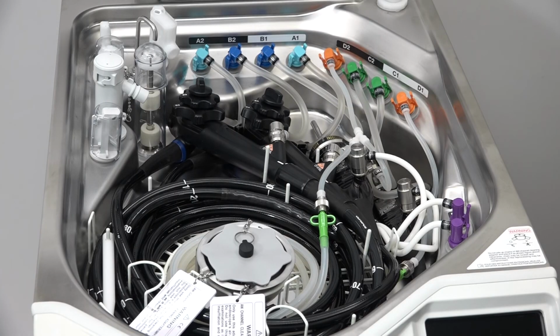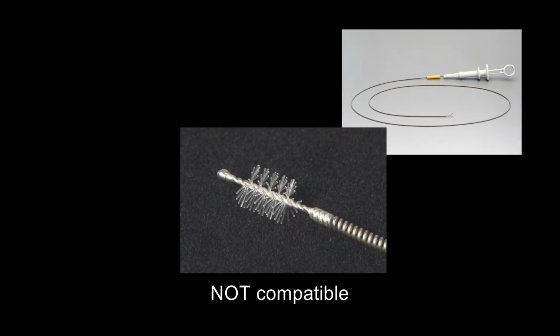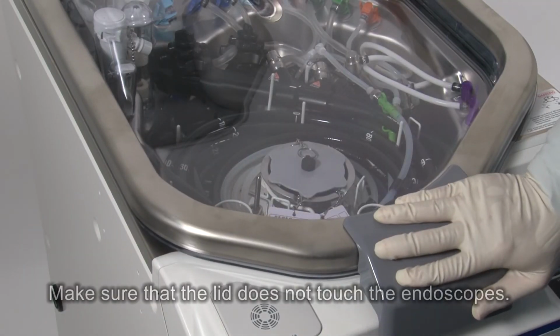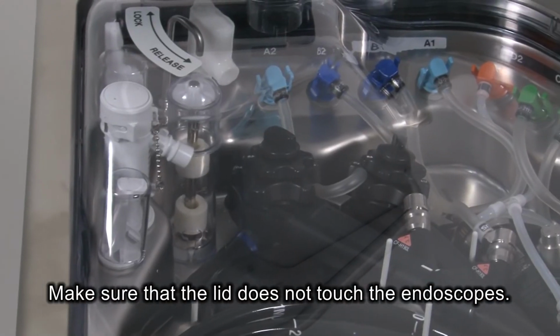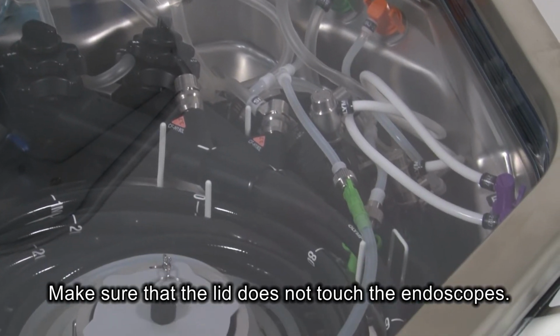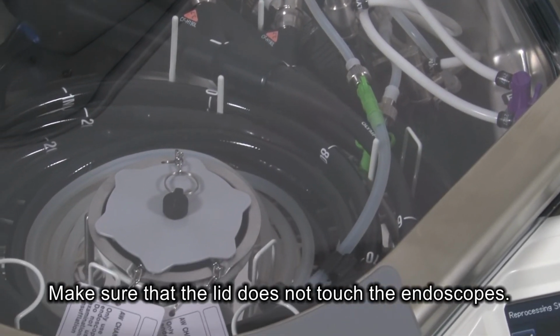Only the endoscopes and endoscope accessories can be put into the OER ELITE. Do not put endotherapy accessories, cleaning brushes, or mouthpieces into it. Close the lid, taking care not to bend the tubes. Also make sure that the lid does not touch the endoscopes.